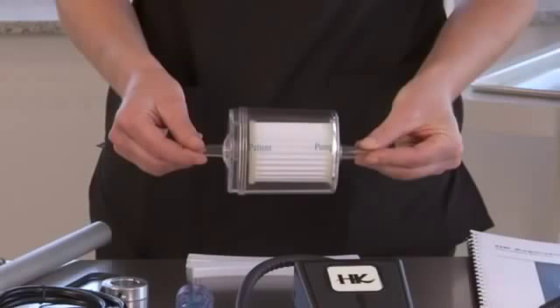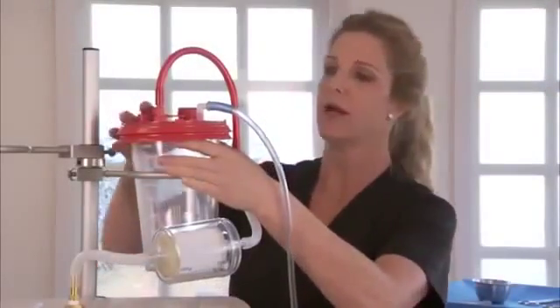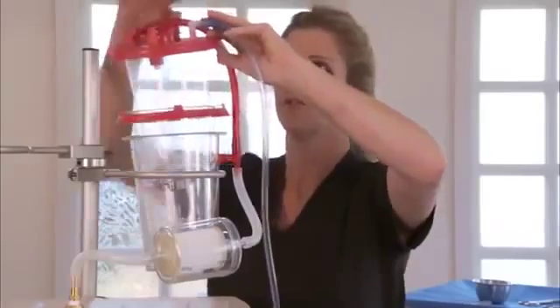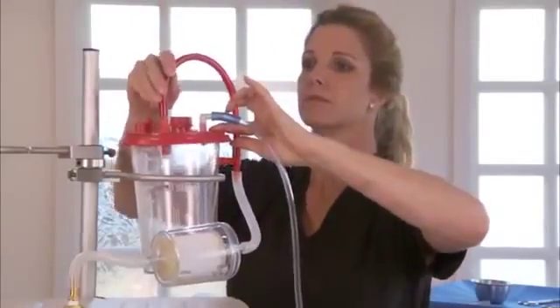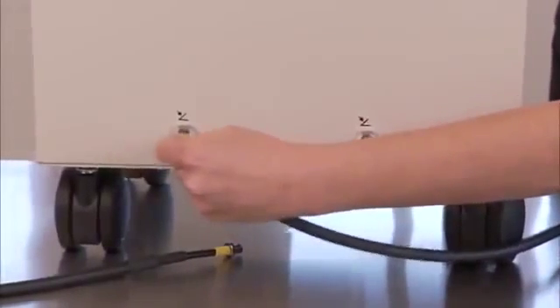Make sure that there is only one filter being used with the unit. Make sure you only have one canister liner, as it's very easy to inadvertently have two. Try each foot pedal and each separate foot pedal port.